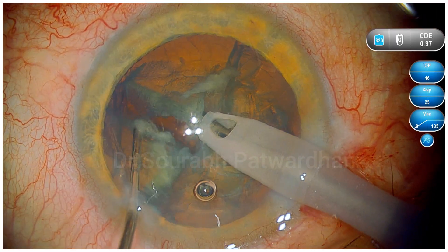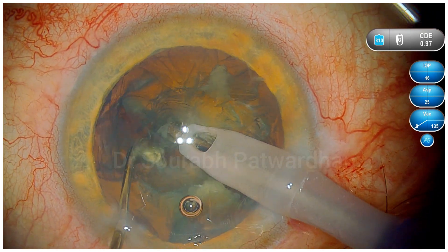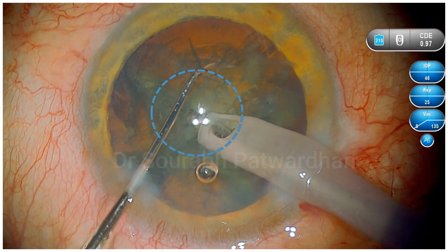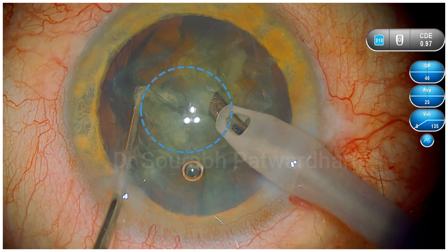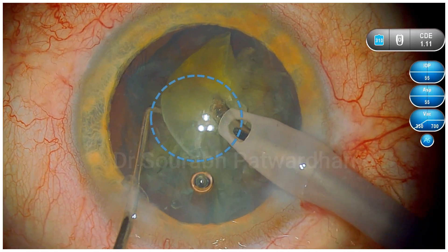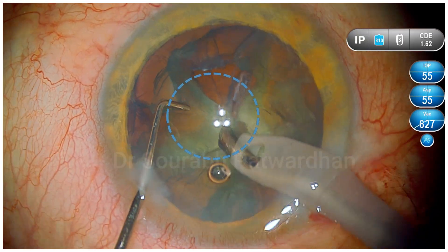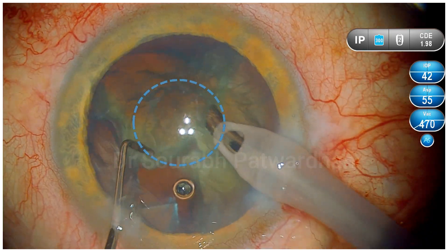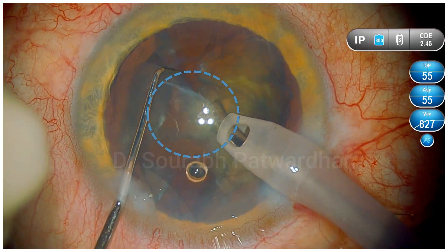You can see that throughout the procedure, my non-dominant hand — the left hand — is more active and going into the periphery, chopping the nucleus into multiple parts. Once I begin the quadrant removal, you can see that my phaco probe tip never leaves the safe center zone of 2 to 2.5 millimeters. Watch that my phaco probe movement is very minimal while my non-dominant hand actually does most of the work.